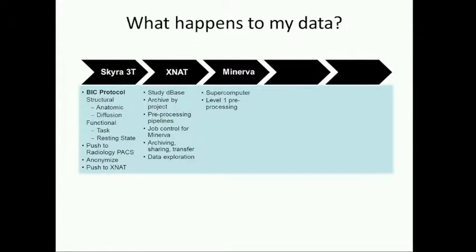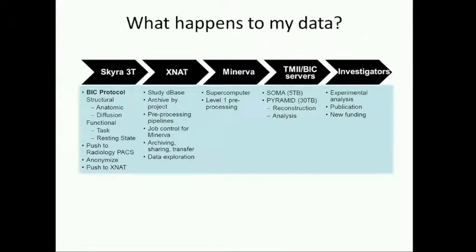Oh, here it is. Look at that. Who knew? Okay, so it goes from the 3T scanner to XNAT to Minerva and the Timmy and BIC specialised servers, which at the moment are both doing similar jobs to each other. And then finally, at any point, the data comes off to you, the investigators.